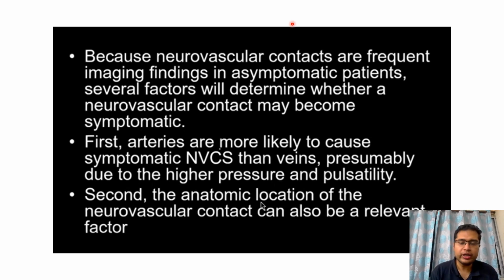In my day-to-day reporting, I encounter a lot of neurovascular conflicts in my CISS sequence or FIESTA sequence, which is not particularly done for a symptomatic patient. But do I have to report all the neurovascular conflicts that I see on my imaging? The answer is no, because it will only confuse the treating physician. Neurovascular conflicts are a frequent imaging finding in asymptomatic patients as well, and several factors will determine whether the neurovascular conflict may become symptomatic or not.